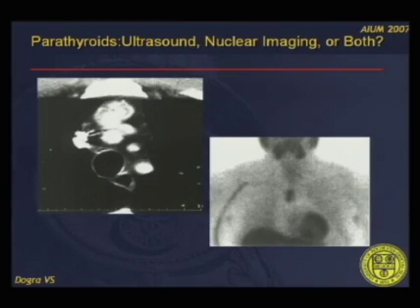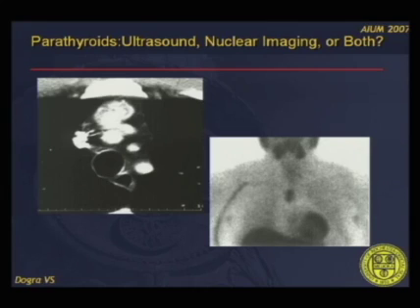This is an example showing an ectopic parathyroid adenoma on CT, with the corresponding sestamibi image demonstrating the ectopic location.